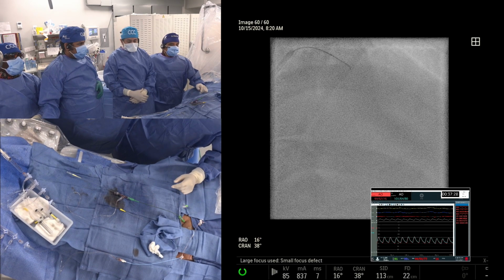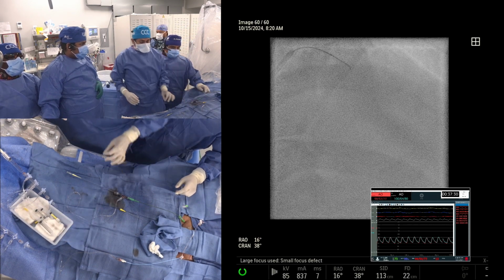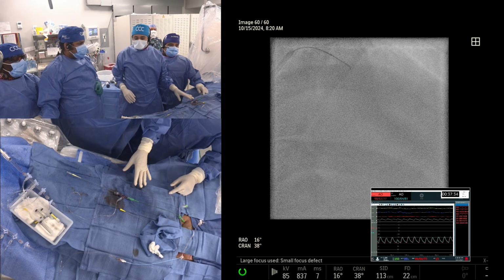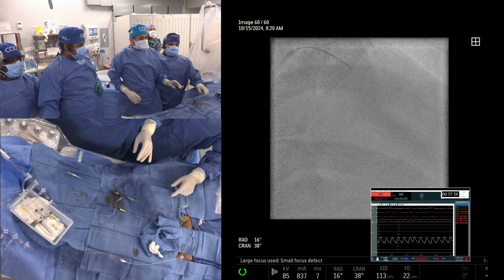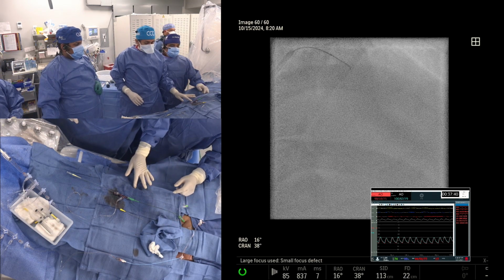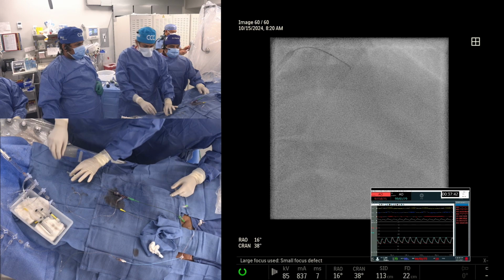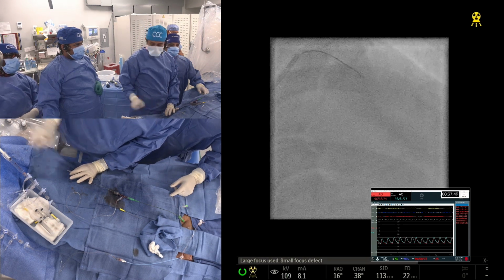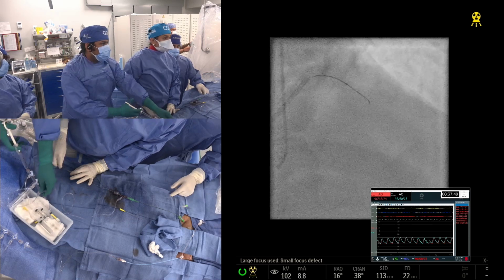I know there are suggestions to go to 7.5. We are doing diagnostic cases at 7.5 now, like pre-op TAVR, cath-only patients. We are doing those at 7.5. Look, when you mention that, I'll just briefly talk about it, and at some stage we should devote more time to it.